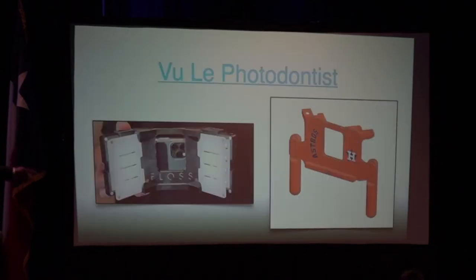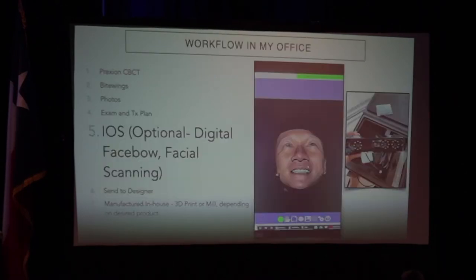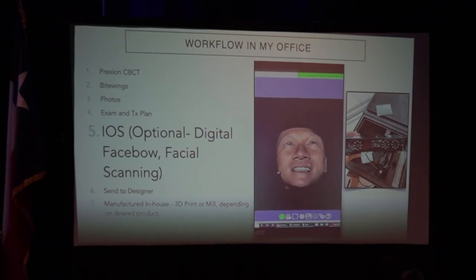This is very cool that we use in surgery. Just use a cell phone. It's going to be the easiest to get to social media. That will light up. I actually brought it in my backpack if anybody wants to see it. It's a few hundred bucks, but it takes great photos. That first photo, the before and after, was actually taken with this phone. So this is an optional part of the digital planning exercise. And I'll play it.